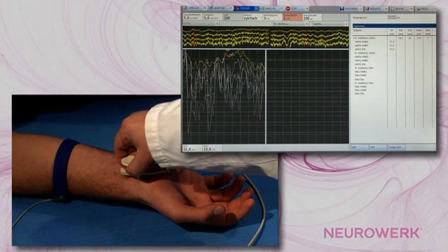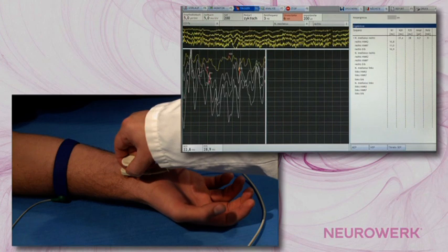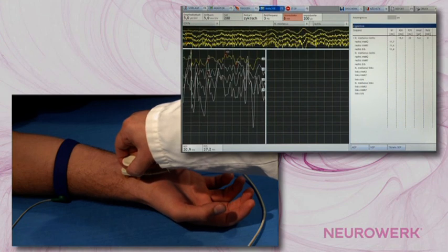After determining the desired stimulation intensity, the signal is averaged 200 times. Each measurement should take place with the same result being yielded at least twice to ensure the reproducibility of the curve.